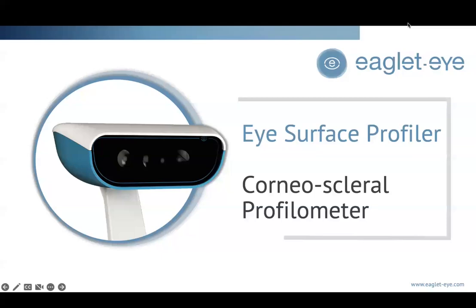My background in using the ESP specifically starts off as a very early beta tester. When I was doing my residency at Pacific University, we started working with the company doing beta testing using the unit. And I have to say it's come a very, very long way. In the beginning, there weren't the same algorithms, which I'm going to share with you, and all of the bells and whistles that the current modern day ESP has, which is such a useful, effective tool.